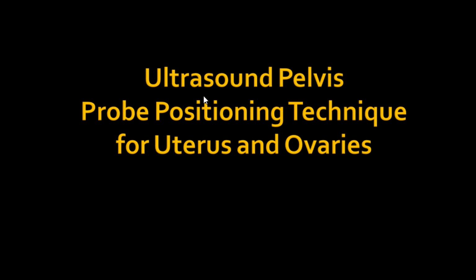Hello everyone, welcome to radiology tutorial. Today we are going to discuss the ultrasound of female pelvis. In this video we will discuss the probe positioning technique for the transabdominal scanning of the uterus and ovaries.